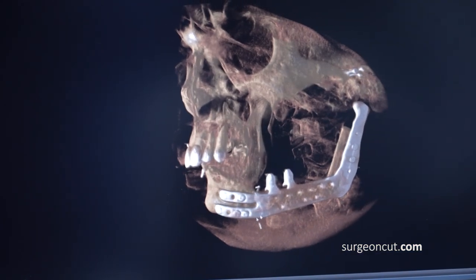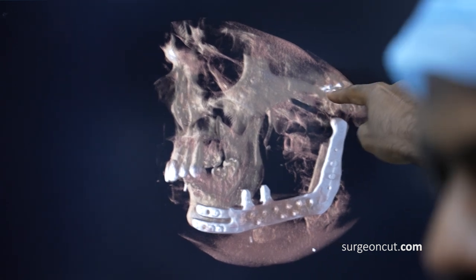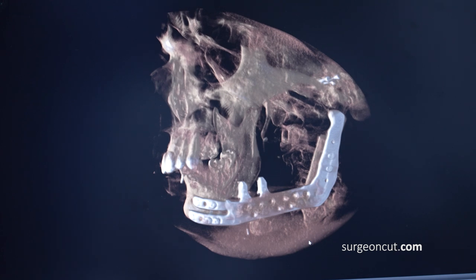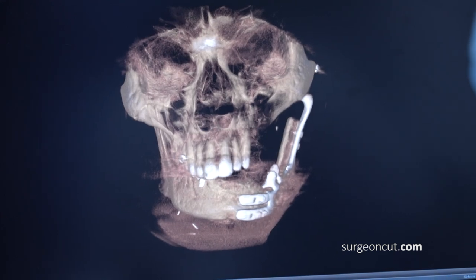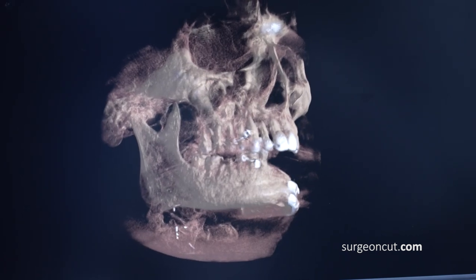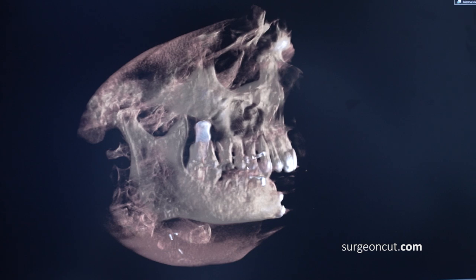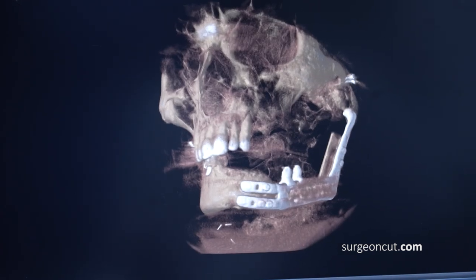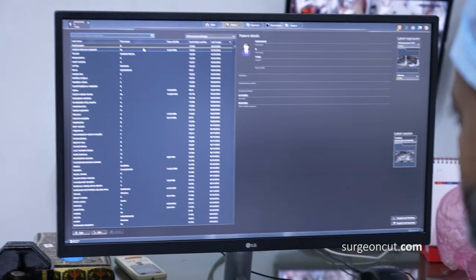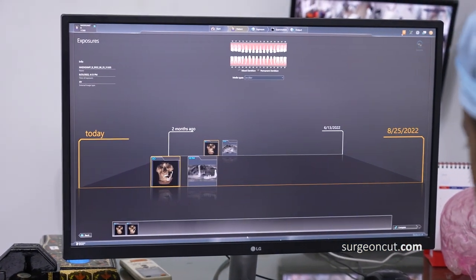So this is the prosthesis we have used. There are a few screws here because that's the prosthesis on the head for the joint. And this is the joint which is done on the lower jaw. And you can see inside, that is a bone that was harvested from the leg. And these are some clips that have come out of the microvascular anastomosis. And you can see the teeth are now joining. I'm trying to go and show you. These are some other views, but we're going to show you some probably clearer views now. I'm going to open just this too.